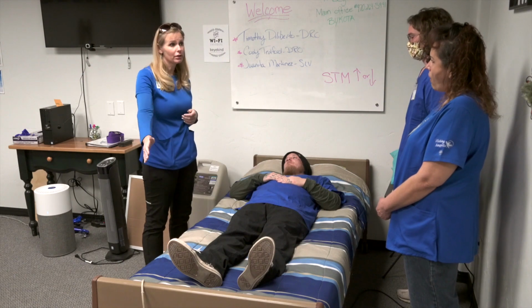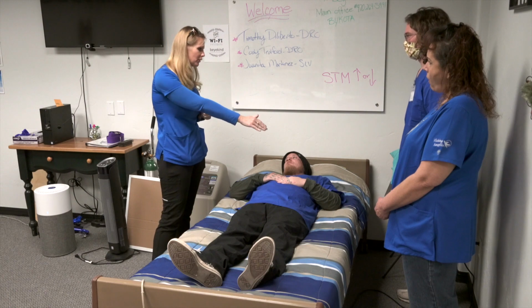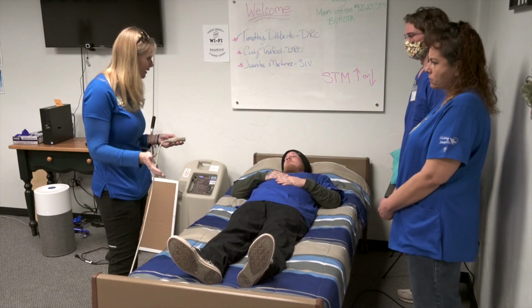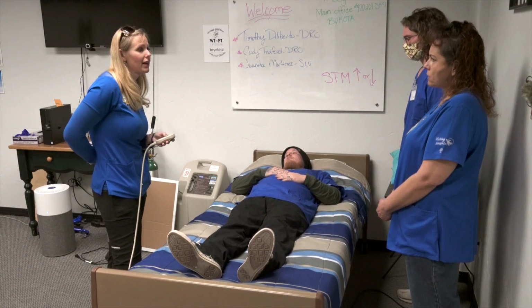So are we going to lock the bed? Yes. We're going to make sure that the wheels are locked, so that they're not going to roll over on the other side. So we want to use the bed, get it to proper height. That way we're not really pulling our back.